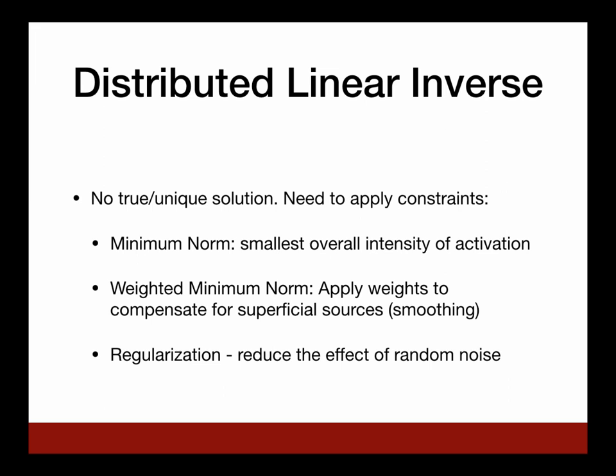Like N170 studies, we get fusiform activation. Gambling studies, we get anterior cingulate. Motor studies, we get motor cortex. It works incredibly well. The problem is that we know that the brain fundamentally doesn't work like this. We know that the brain has particular sets of neurons or sources that fire in response to particular things. So when you get visual stimuli, you should see visual cortex activation and probably less so other activation. All the voxels aren't on at the same time.